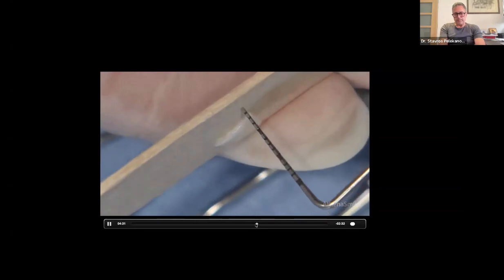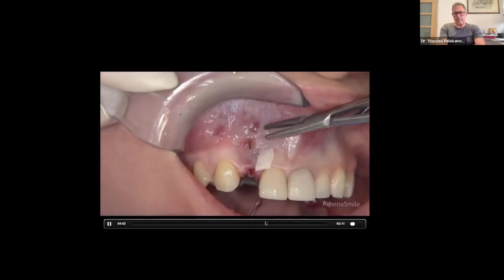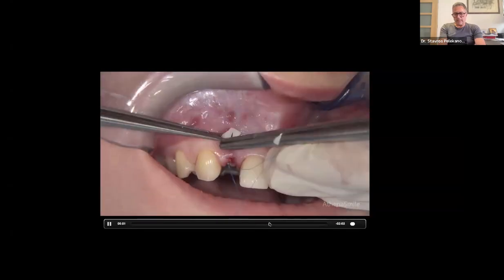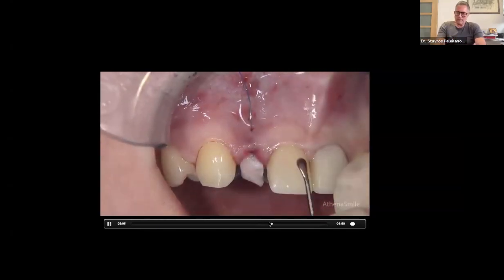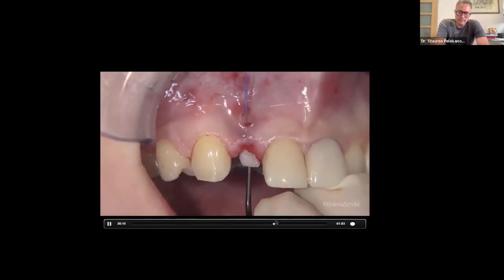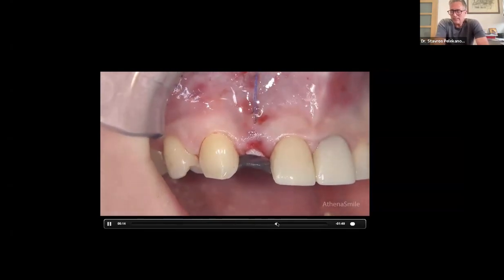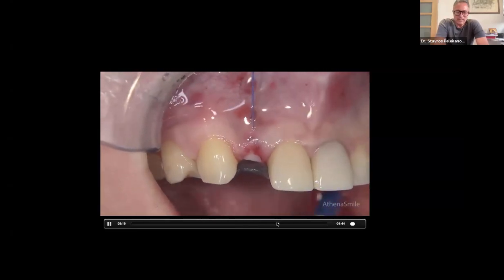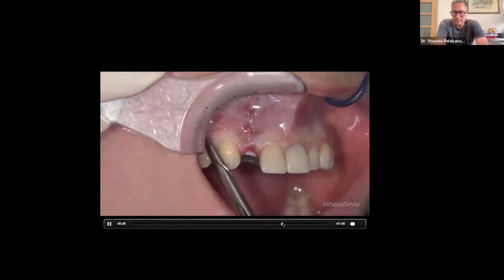And then we are placing the connective tissue. And in the meanwhile, because we did this case with Sandro, maybe Sandro, you remember, Sandro is producing in the AI software of TRI extremely fast. Like I put the time and he needed only like 1-2 minutes to make the digital crown.